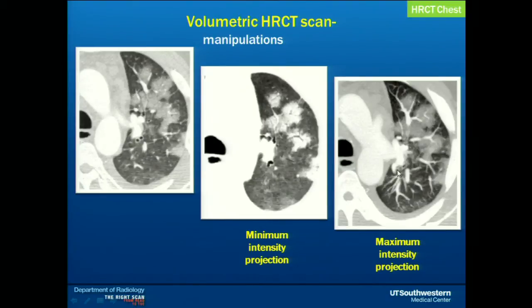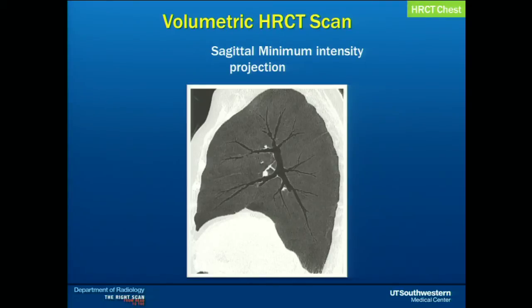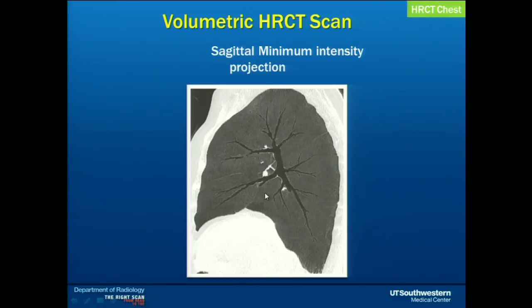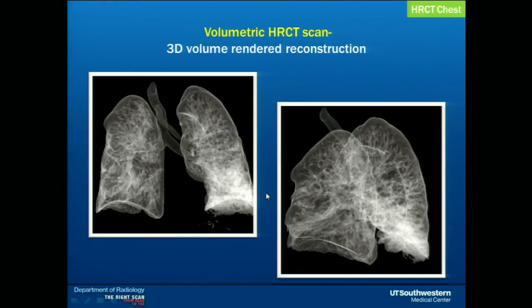This particular image is a maximum intensity projection image, which highlights pixels that are very high in attenuation, so vessels can be seen nicely going into these lobar consolidations. This is a sagittal minimum intensity projection image, which highlights the contrast between the airways and the lungs. The lungs have diffuse ground-glass opacities — a finding very subtle on axial images — but this reformat shows the contrast difference clearly. You can also do 3D volume rendering reconstruction showing the extent of disease on PA and lateral projections.